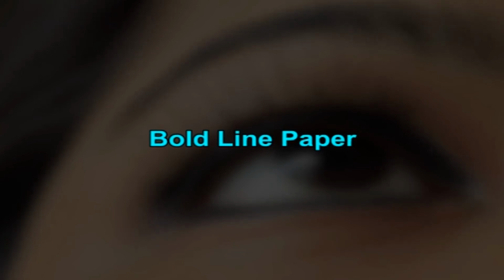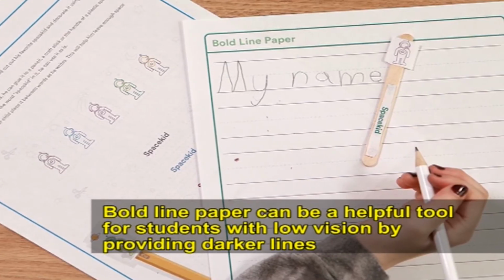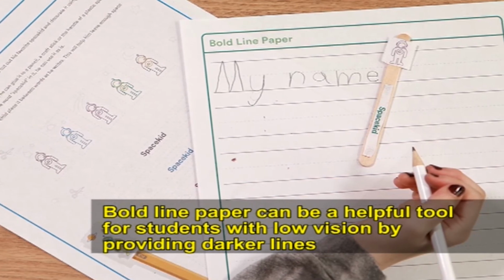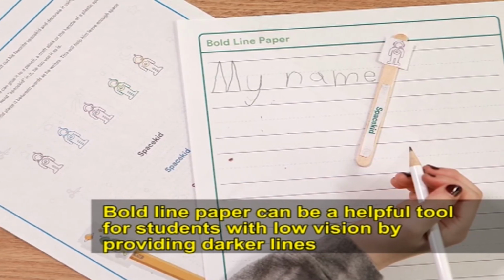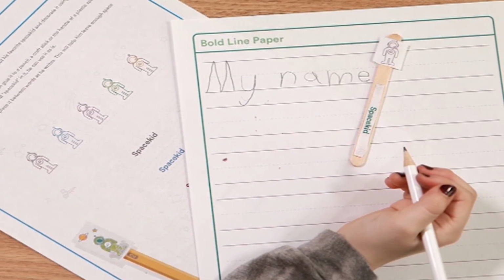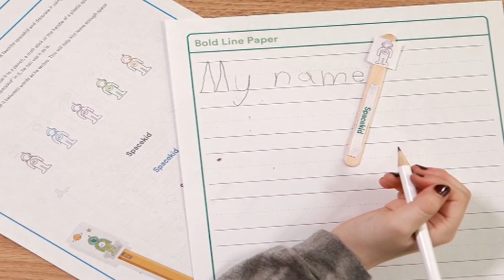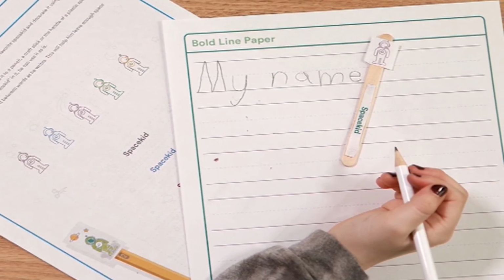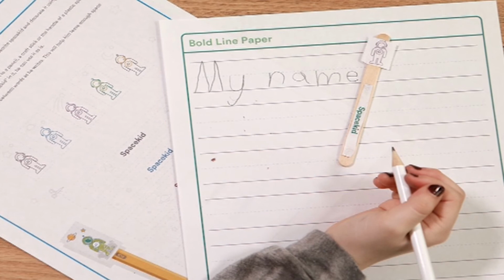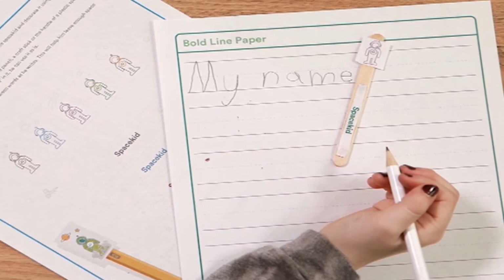Bold line paper. Bold line paper can be a helpful tool for students with low vision by providing darker lines. Bold line paper comes in various formats such as writing paper and graph paper and allows a student to write script on a line or to contrast a graph with increased contrast.